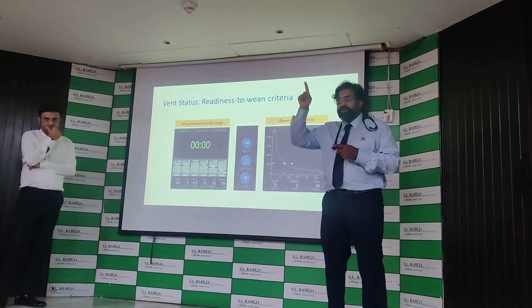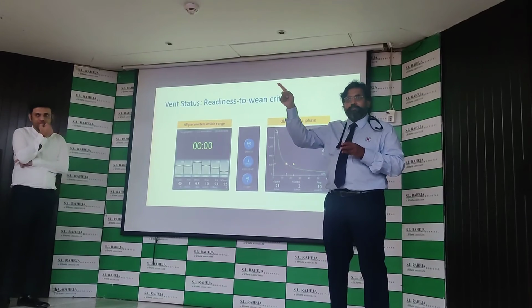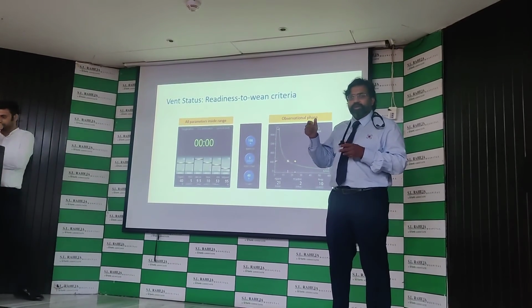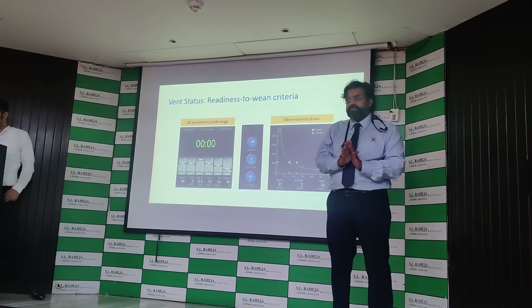That is why you have the range up to 350%. You understand? So keep increasing it till you reach that the patient is now not distressed.